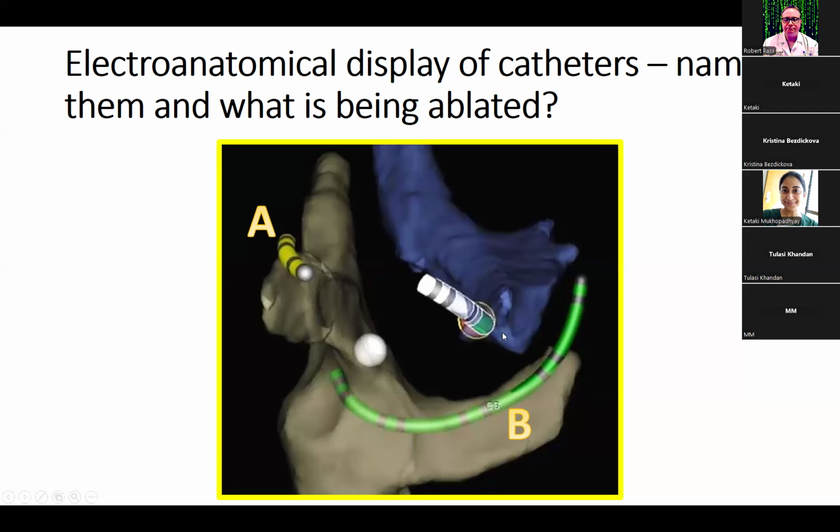And just so that we all are on the same page, what is the normal convention of describing where you are, like when we say left posterior or left lateral? When you're in the LAO view, we think of the mitral annulus, it's here, right? Virtually. And we think of it as a clock face with 3 o'clock being over here, and that would typically be left lateral. This would be anterior, this would be posterior. So this would be, I guess we would say, left posterior to left posterolateral.